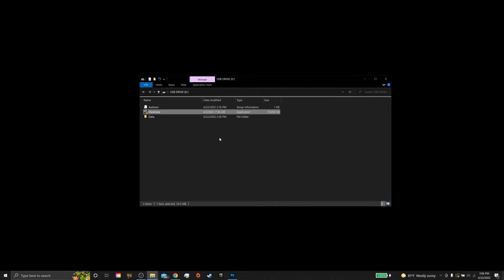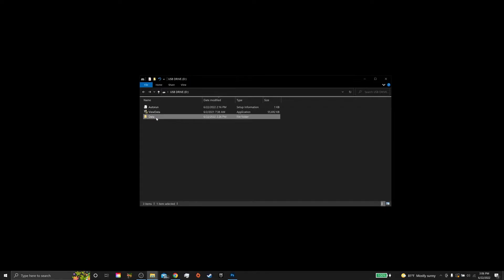There are a couple different ways to view the radiograph right on the USB drive itself, and another way we're going to talk about as well. The first and simplest way is if you already have 3D viewing software that allows you to view DICOMs on your computer, just open up the DICOM right from the thumb drive.